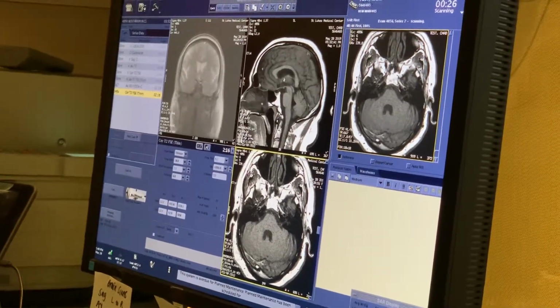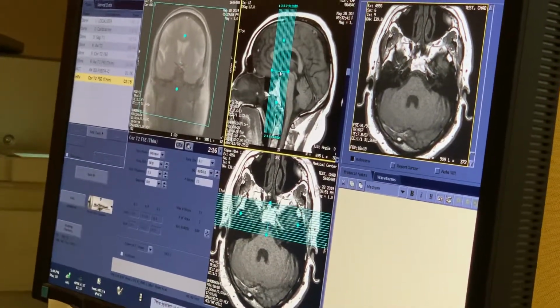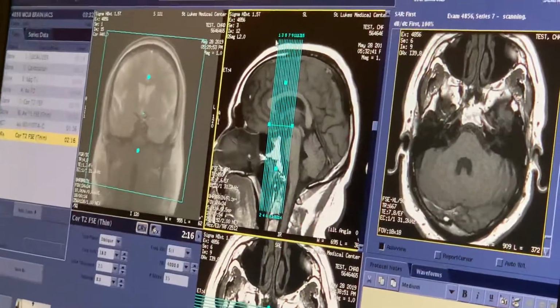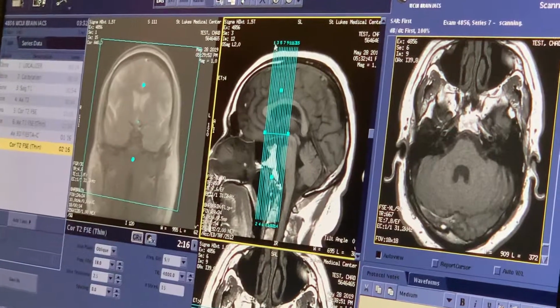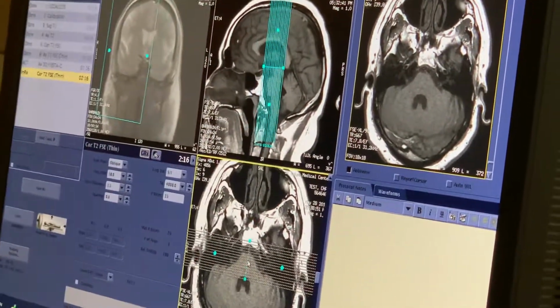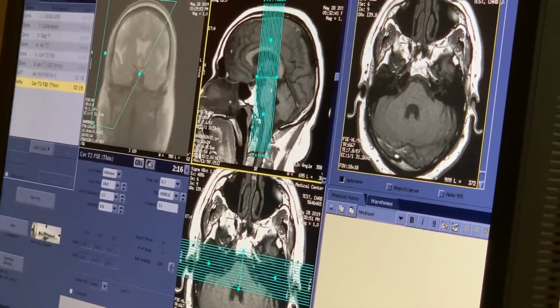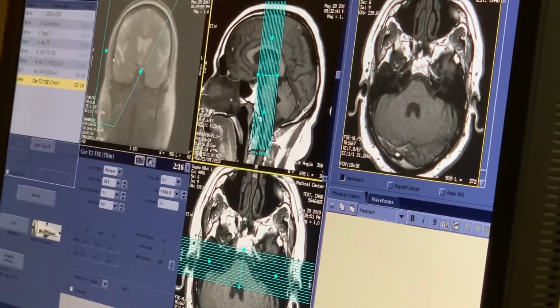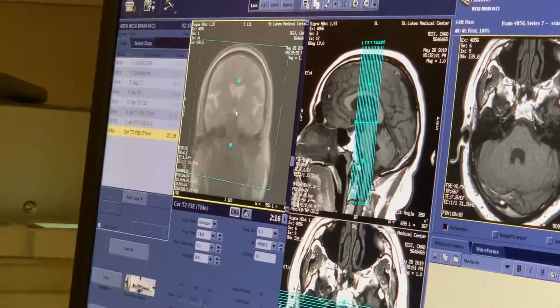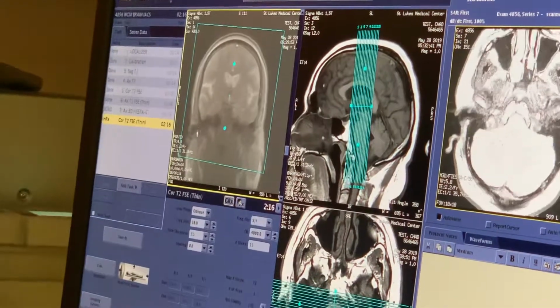For a coronal, I'm going to throw down in the sagittal plane. You can throw down in the axial if you'd like, but I'm just used to throwing down in the sagittal plane. We checked our direction, and this is correct. We're going from anterior to posterior, so that looks good. And then I'm just going to throw this over top of here. And again, we're just going to angle with the back of the brainstem, just like we always have, and come into this, and center up there. I just want to make sure I center in the middle of the brain.